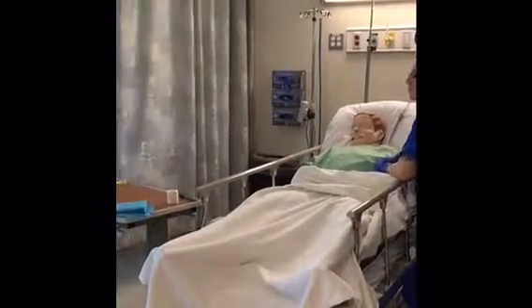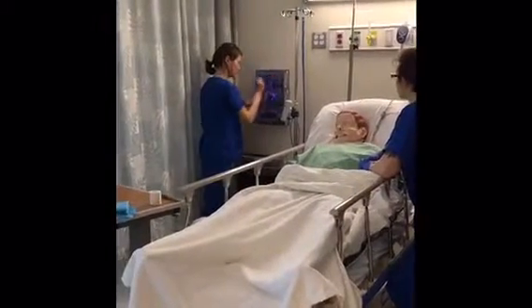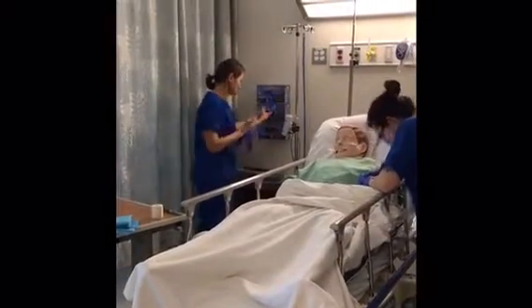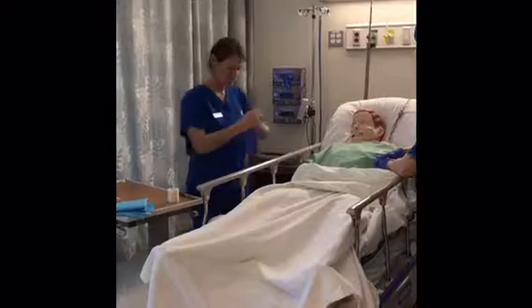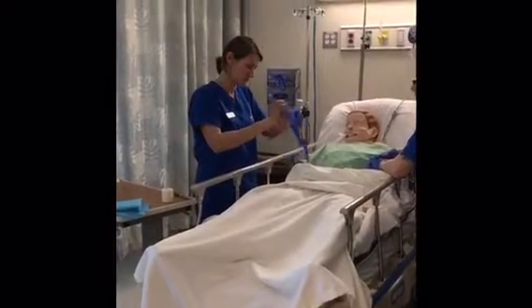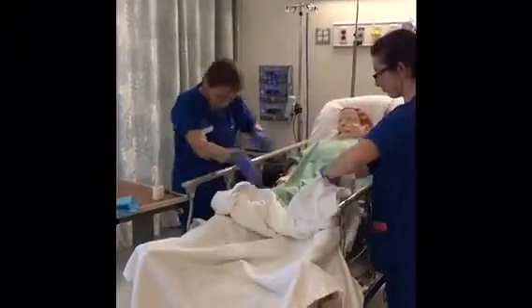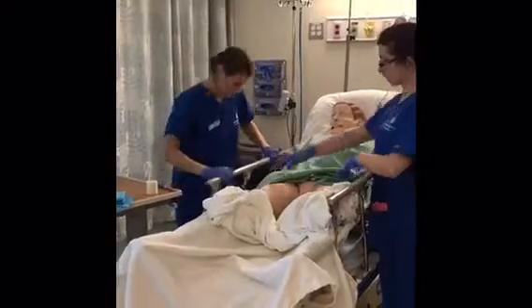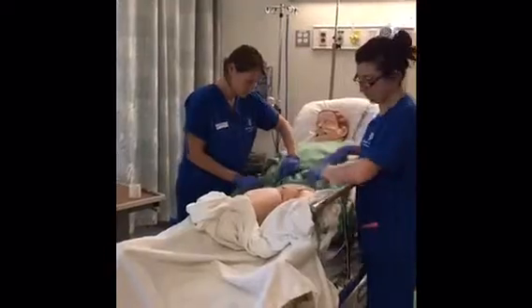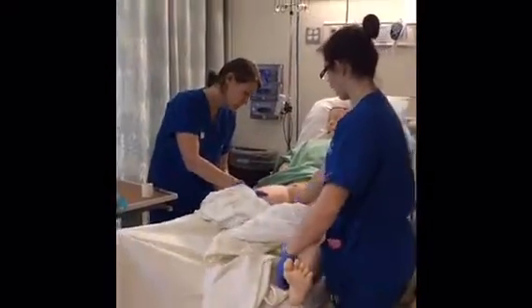Going to gather my supplies and equipment, provide privacy. Position my patient. First, I'm going to grab my gloves. So clean technique, positioning my patient. Knees wouldn't go up, so they are just going to be spread open, with my assistant, Holly.